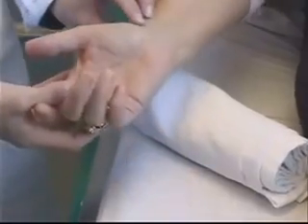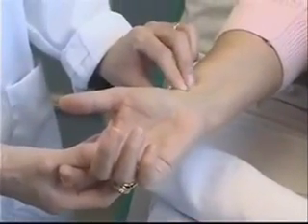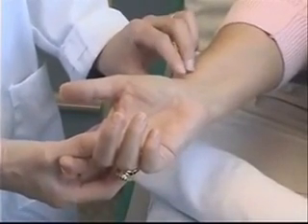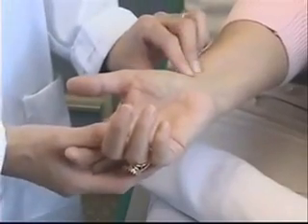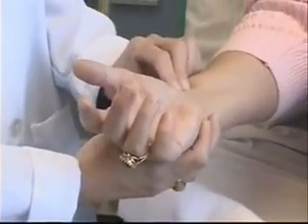We'll begin the procedure with performing the Allen's test. The most common site chosen for blood gas sampling is the radial artery of the non-dominant hand. Once you've chosen the hand, before you can proceed with the procedure, you must first perform an Allen's test which indicates whether or not there's collateral circulation to the limb.